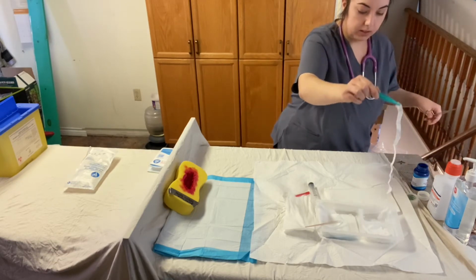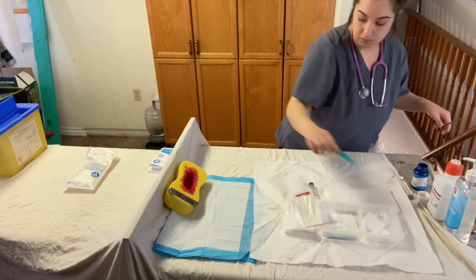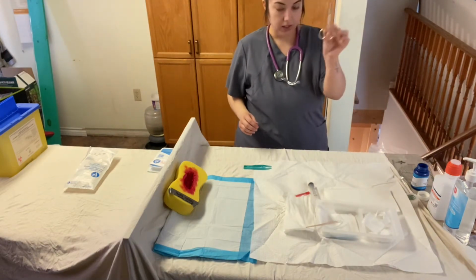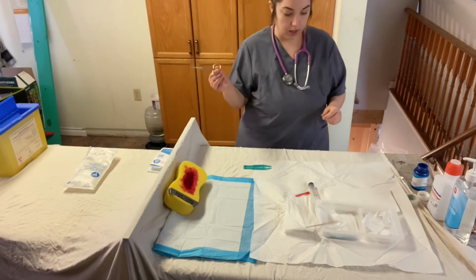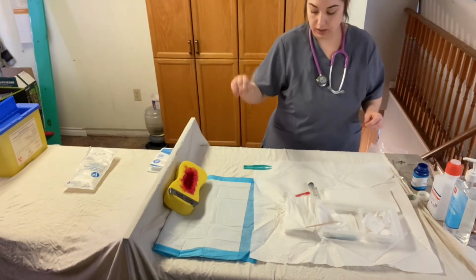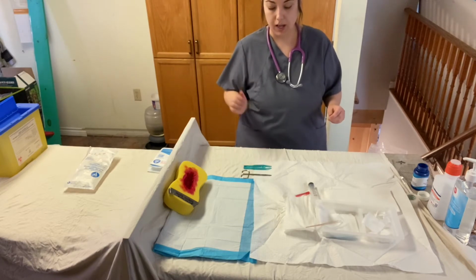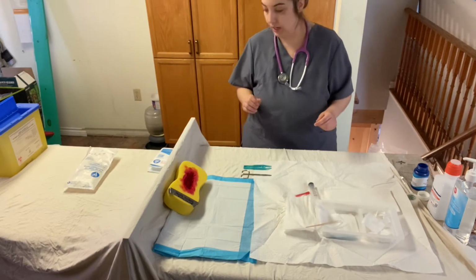And I'm just going to place that in its own separate tray. Perfect. I'm going to place that within my 1-inch border there again, just adjust it. And these as well, I don't know if I'm going to use them again, but if I do, I'd like to make sure they're still sterile. So placing within my 1-inch border, keeping that handle that's now not sterile outside.